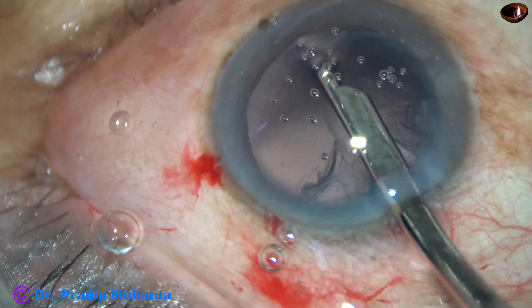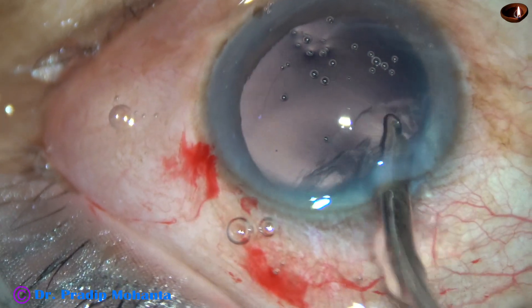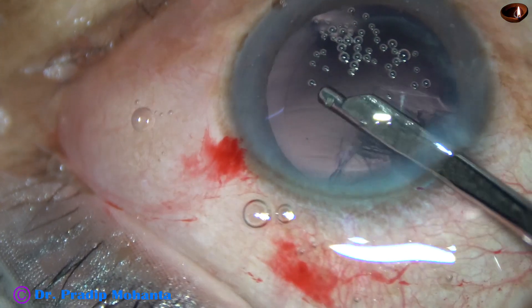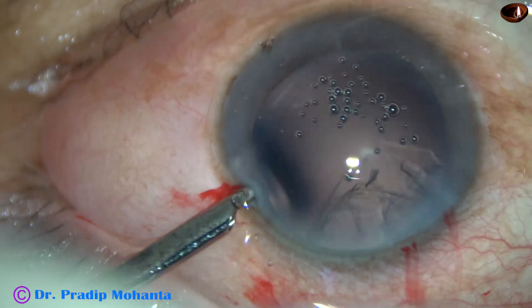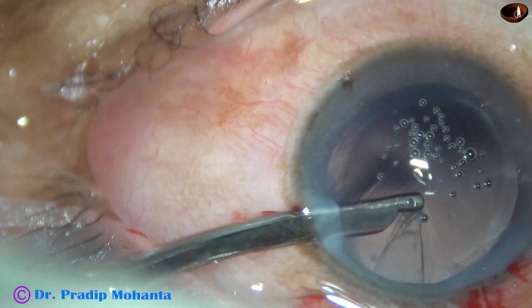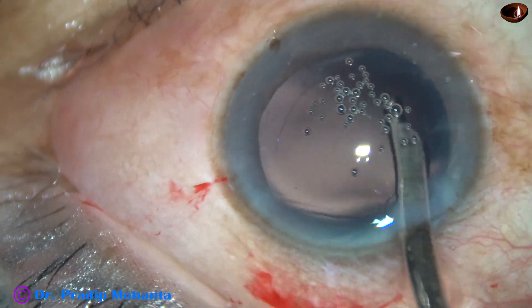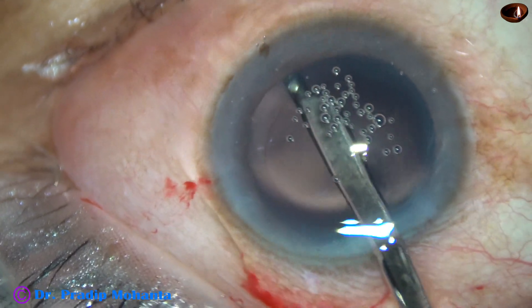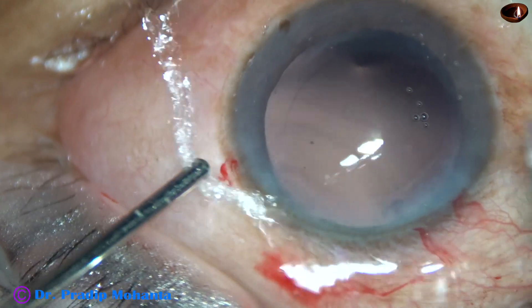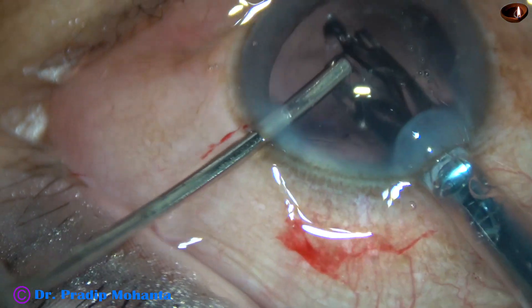Congratulations to Dr. Suhail for designing this pre-chopper. This will be a great thing for Indian ophthalmologists because we cannot afford very high-cost instruments. Since it is designed by an Indian surgeon, it will be manufactured by an Indian company, making this instrument very affordable to us.